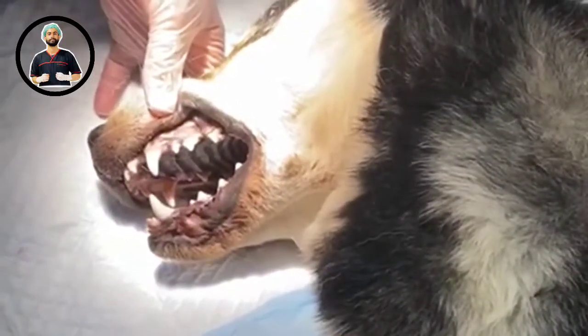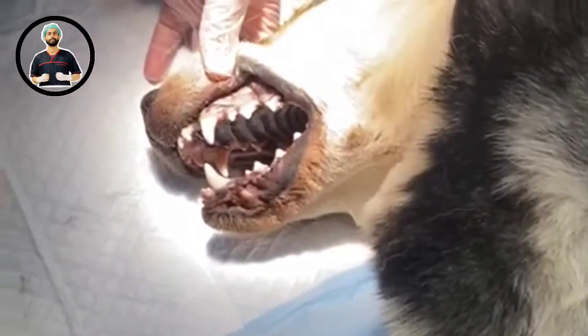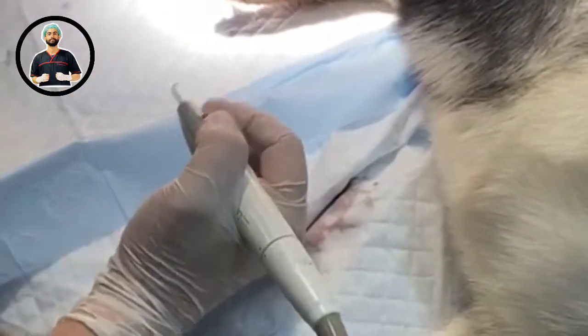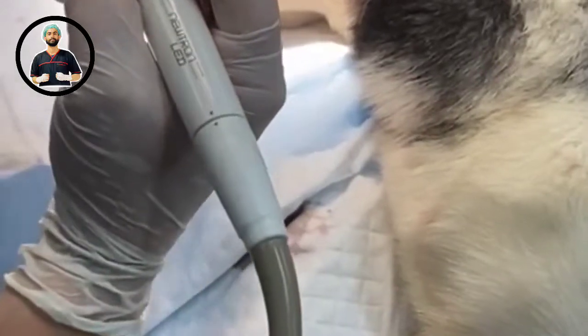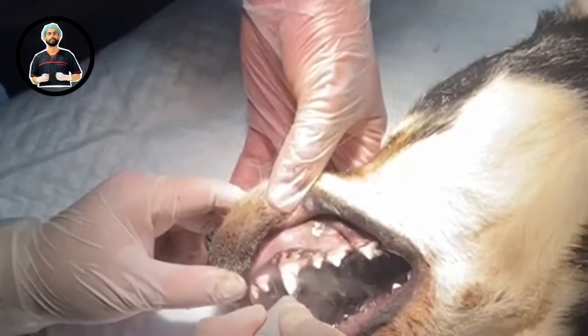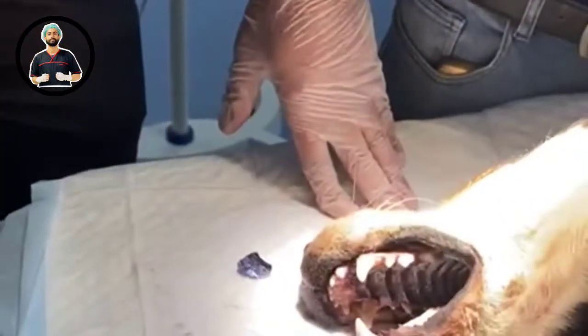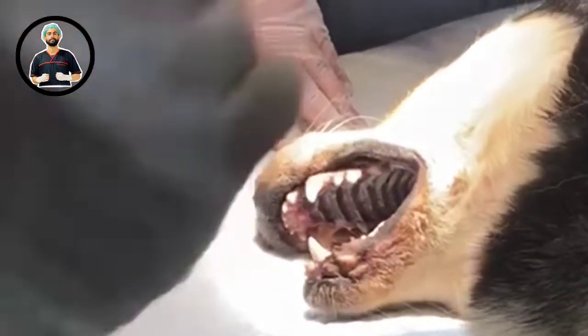The ultrasonic scaler produces heat, which is why we have water on there to cool the tip. The water doesn't need to flood the dog — I've seen dentals where it's like a swimming pool, which is unnecessary and causes extra work. You don't want any more than just enough to keep the tip moist. On each tooth, go one, two, three, four, five seconds — no more than 10 seconds per tooth because of the heat produced.